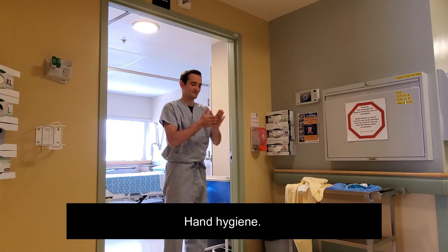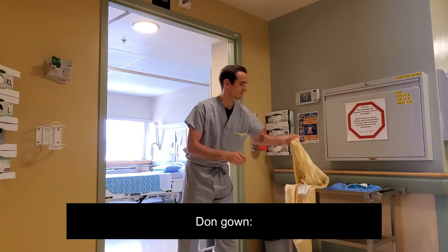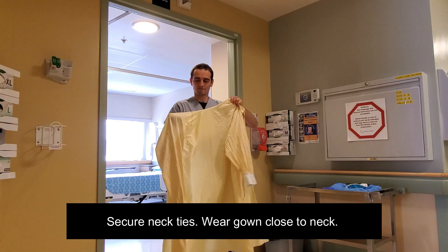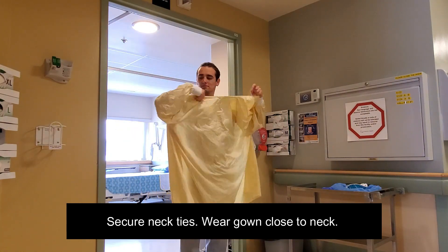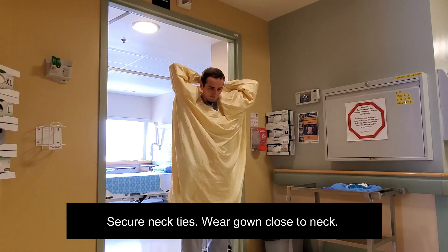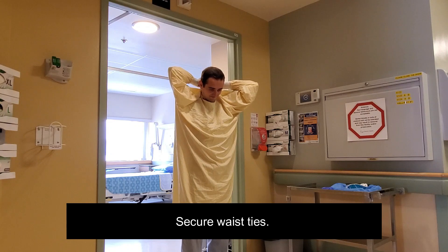Perform hand hygiene. Don the gown by securing the necktie. Pay attention that you wear your gown close to your neck. Secure the waist ties.